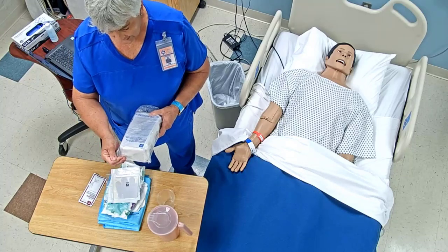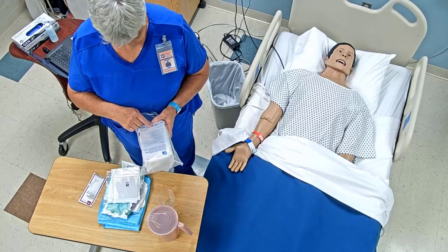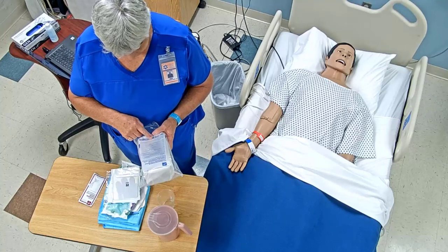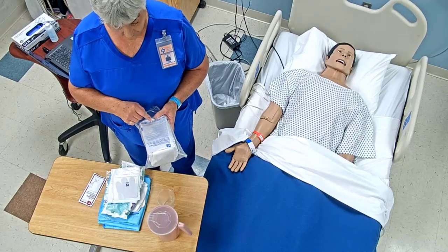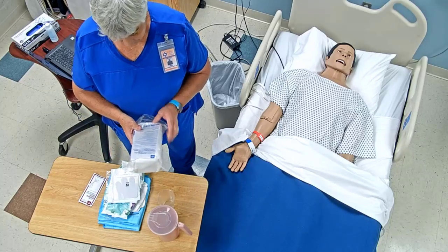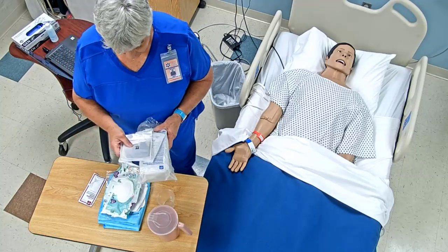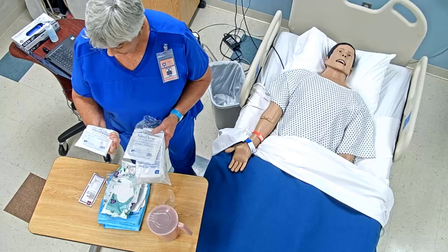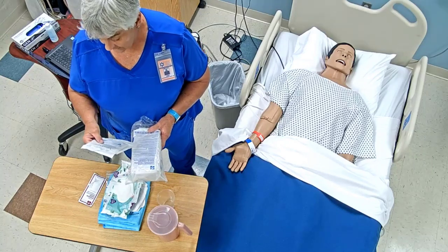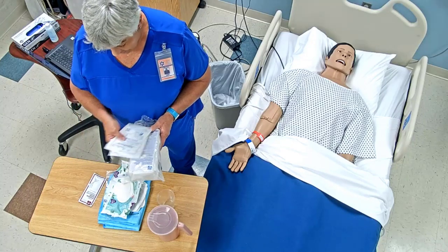I'm making sure that my package is intact, and that the expiration date on here, 7/28/2026, is good. Making sure my package is intact also guarantees the sterility of it. And I've got my extra size gloves just in case. This says sterile unless package is damaged or open, and this also has an expiration date on it, so I'm making sure that all the expiration dates are good.